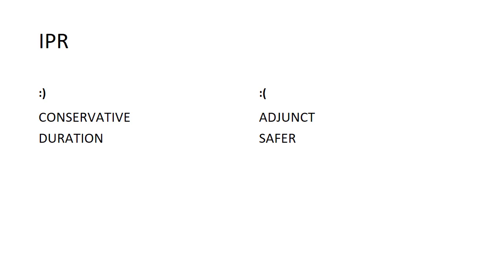The first drawback is that it cannot be used as a sole method of creating space during orthodontic treatment. It is better if you use this process as an adjunct to create space. In the sense, IPR should be used along with arch expansion, dento-alveolar expansion, or skeletal expansion to create space, and it should not be used as the sole method of space creation. Second thing is, it is better to be as conservative as possible. Yes, according to Sheridan and many authors, you can create almost 8 to 9 mm of space with the help of IPR only.